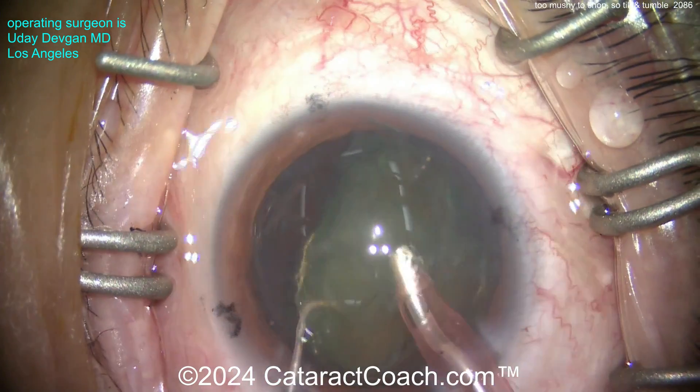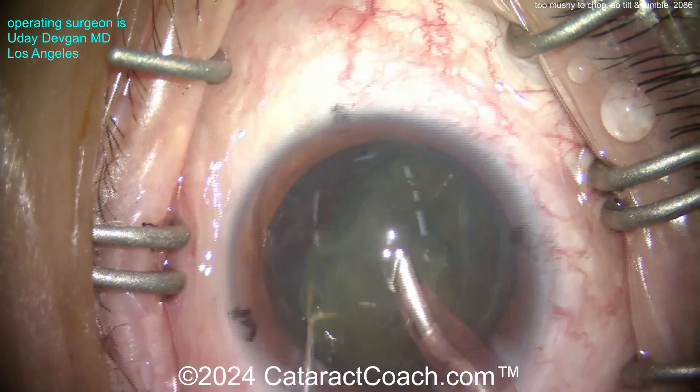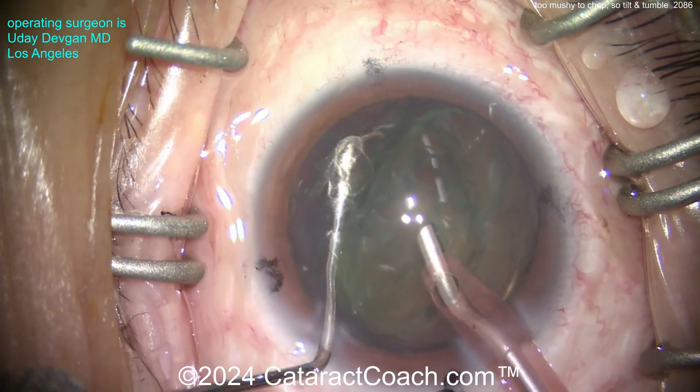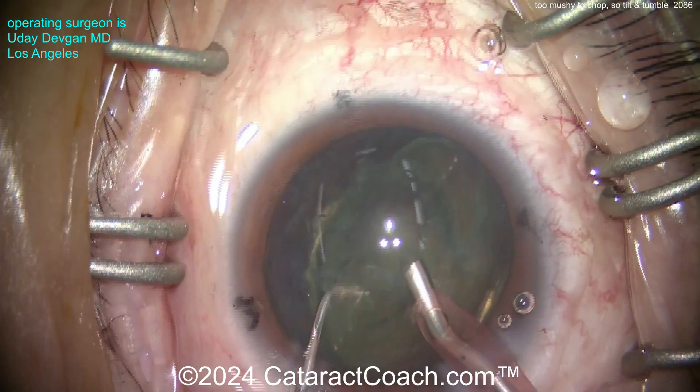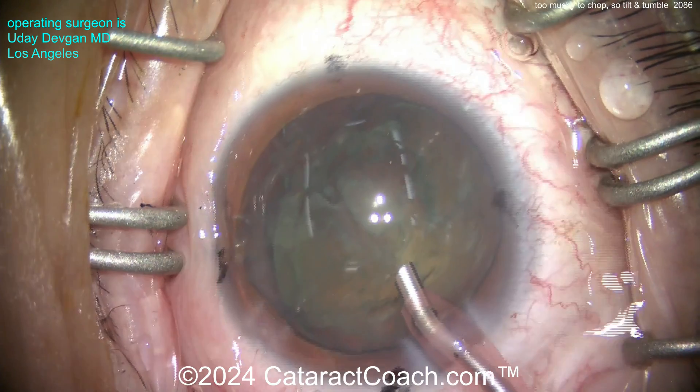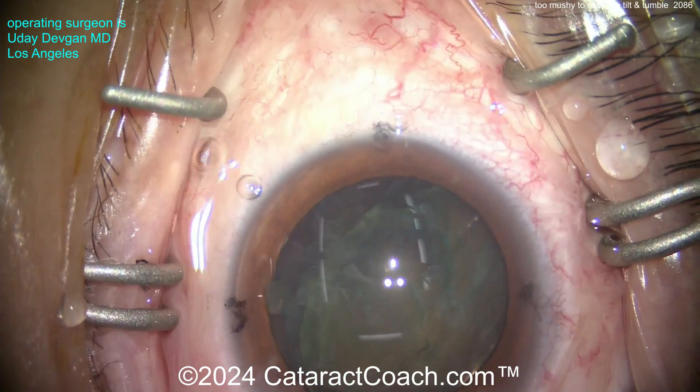Too mushy. So all we have to do is just tilt and tumble. It's tilted out of the bag - just tumble it into the phaco tip. We're using some phaco power modulations like a pulse mode with a low duty cycle to minimize the total energy.